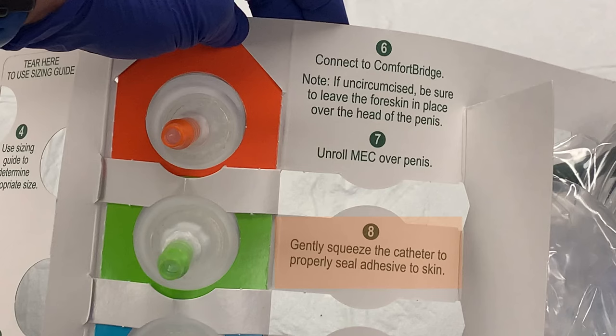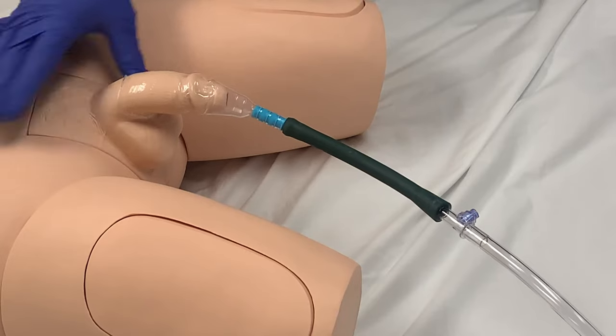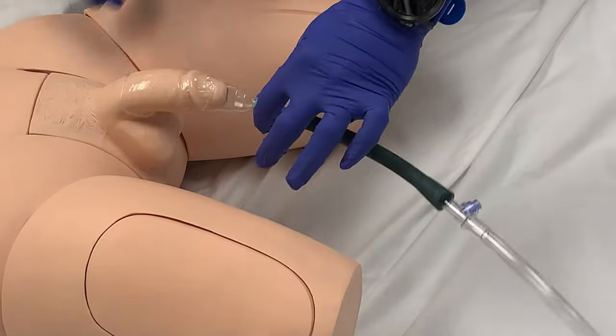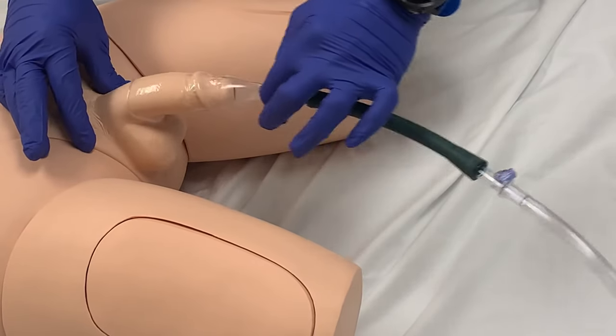Step eight is to gently squeeze the catheter to properly seal the adhesive. Ultimately, this step ensures that the catheter material is in contact with the skin at all points. This helps avoid leaks and ensures that the catheter will remain in place.